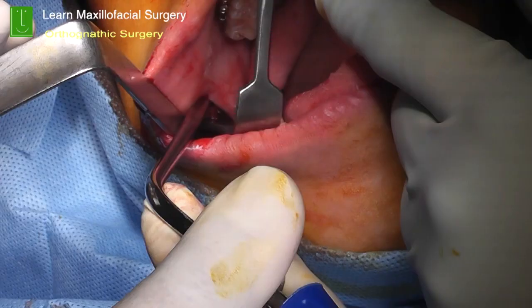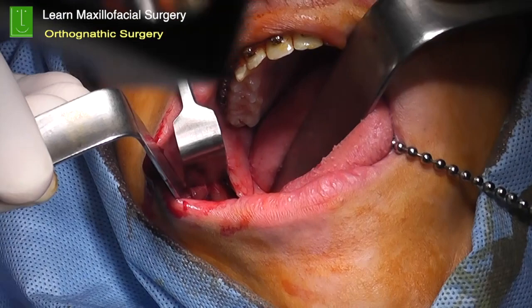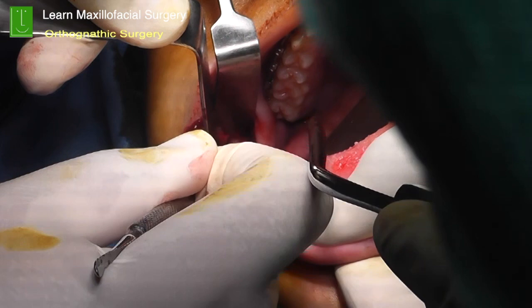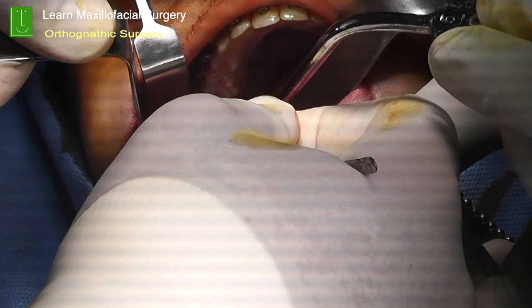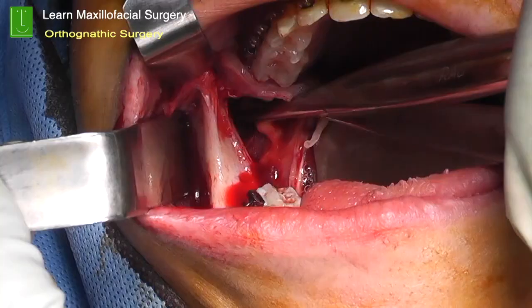A subperiosteal dissection is carried out so that the entire flap can be raised. And then as we go distally, you can use a forked ramus retractor on the anterior border of the ramus of the mandible. This fork helps in retaining the position there on the anterior border of the ramus and retracts the tissues beautifully, giving a very nice exposure to the ramus of the mandible. Once the buccal area has been exposed, then we go on to the lingual side.